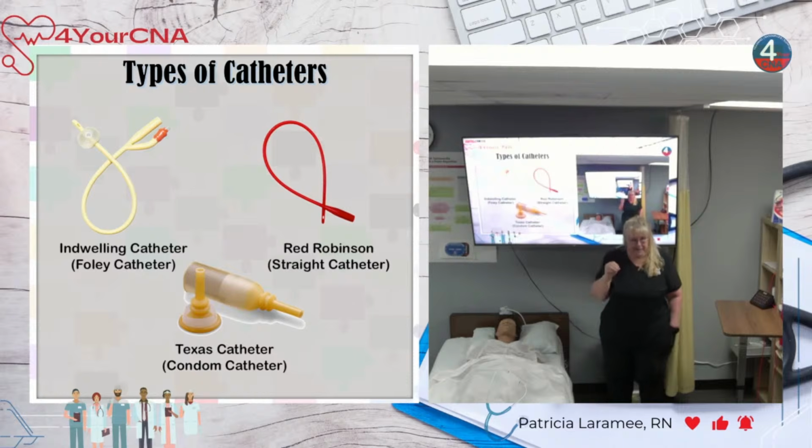In most cases, when we have this, we use something called skin prep, which looks like an alcohol pad, and you wipe it on the skin and it provides a protective barrier. It's kind of like nail polish. You know how nail polish, when you put it on your fingers, is an extra layer, right?